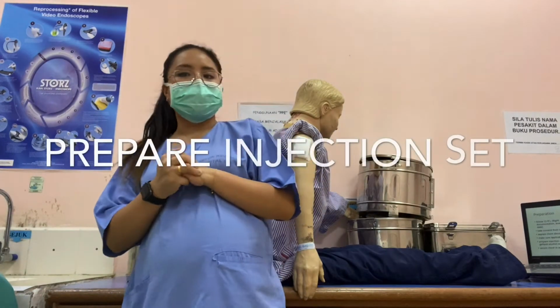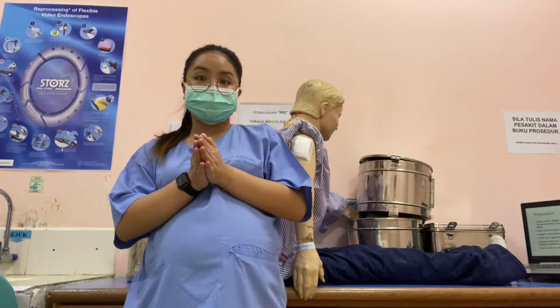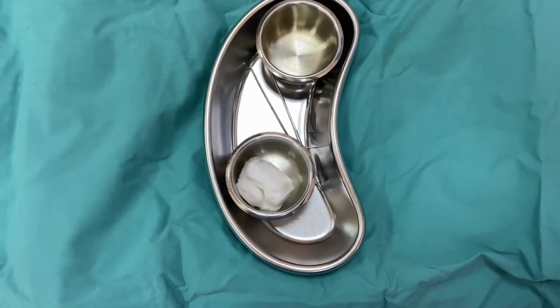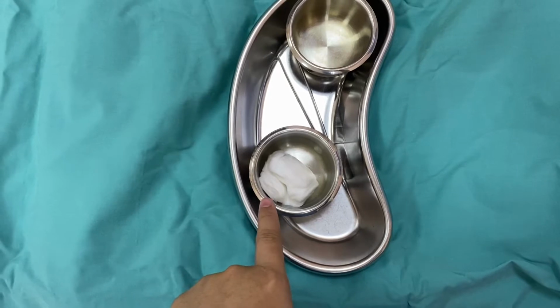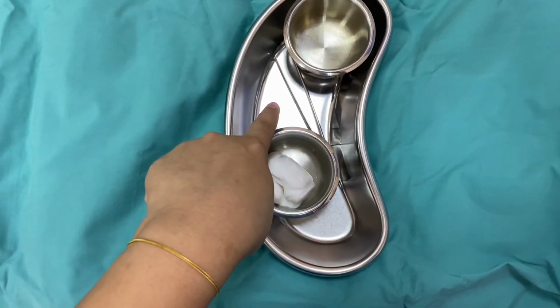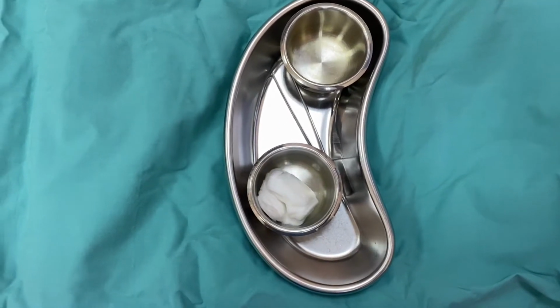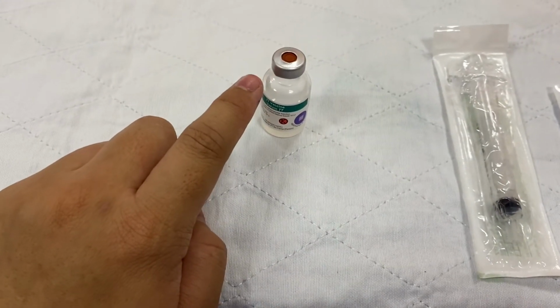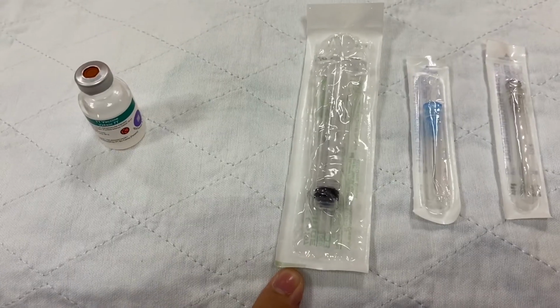And then prepare an injection set. These are the injection set. You have the gallipot, the alcohol cotton swab, forceps, kidney dish, and any other equipment. These are the medication that we will give to the patient. This is the syringe.